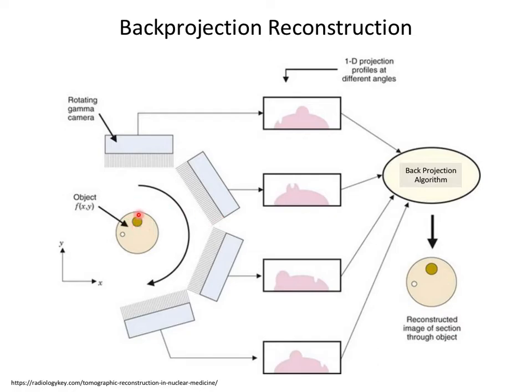I know it's this bright object. So when I intersect those 2 signals, I'll get a big pulse of stuff here. But it won't be the right shape and everything. But it kind of positions where it is. All you know is it's right about there. So if I have a dot, like say I have a point source, right? How many projections do I need?